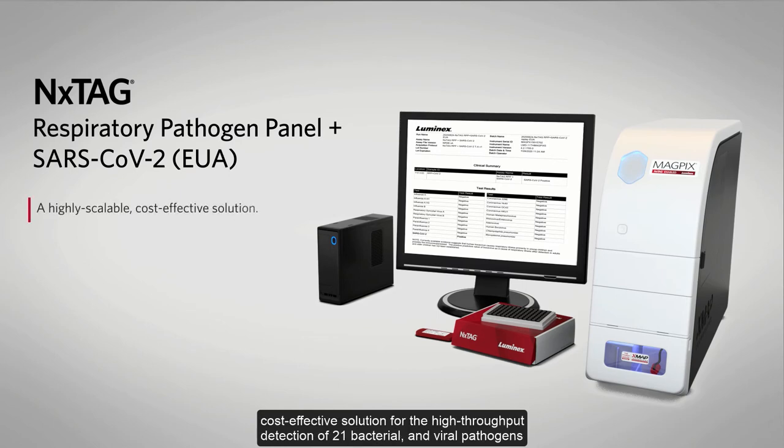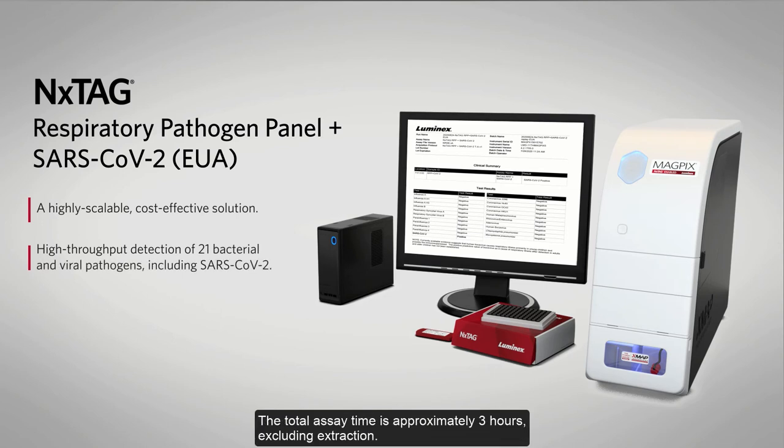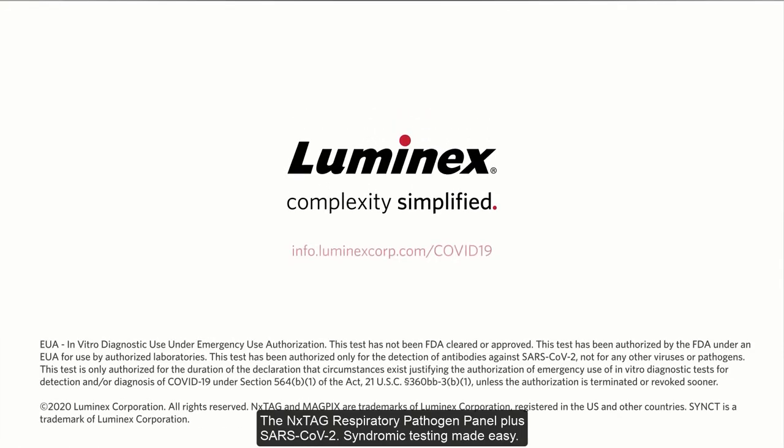The Nextag Respiratory Pathogen Panel plus SARS-CoV-2 is a cost-effective solution for the high-throughput detection of 21 bacterial and viral pathogens, including SARS-CoV-2. The total assay time is approximately three hours, excluding extraction — Nextag Respiratory Pathogen Panel plus SARS-CoV-2 testing made easy.